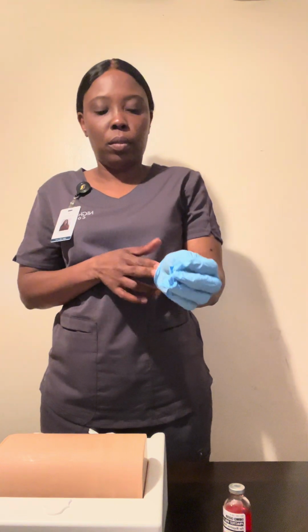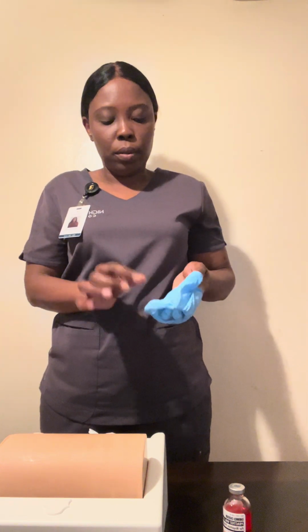And then I'm gonna remove my glove, turn it inside out, and sanitize my hands. I'm gonna make sure my patient is comfortable, and then I'm gonna document my procedure, give my patient privacy, and close the curtain as I leave. Thank you.